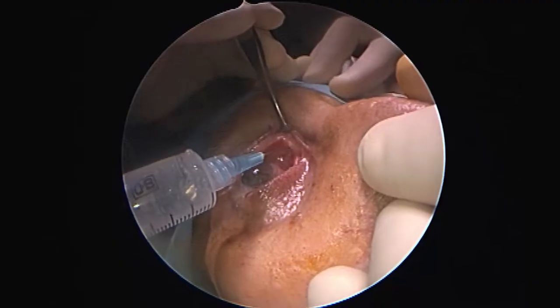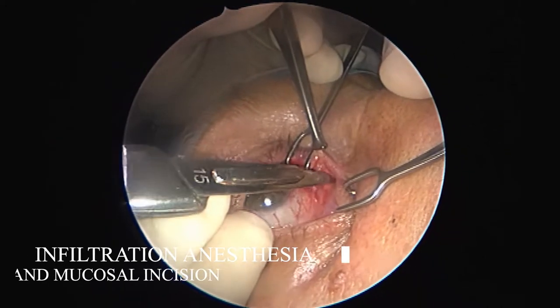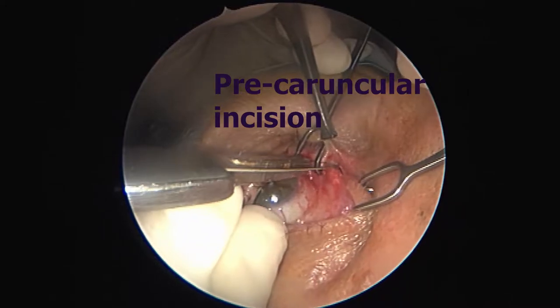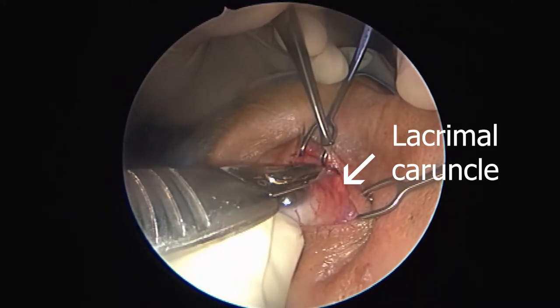Welcome to this video describing ethmoidal artery cauterization surgery using the precaruncular approach. After mucosal infiltration anesthesia, including adrenaline as a vasoconstrictor, we proceed to the mucosal precaruncular incision.